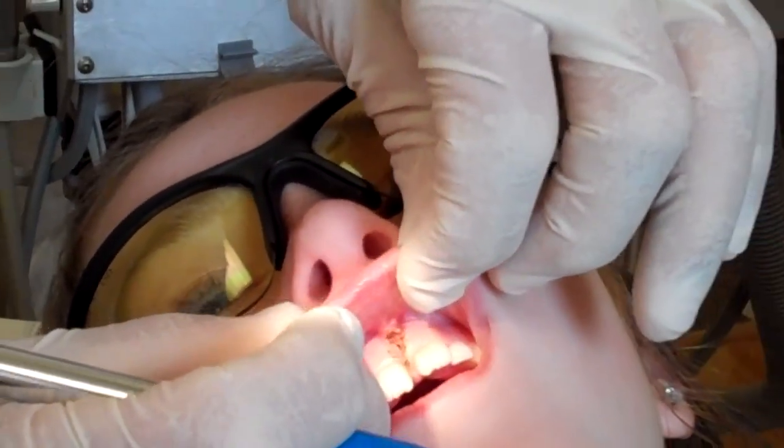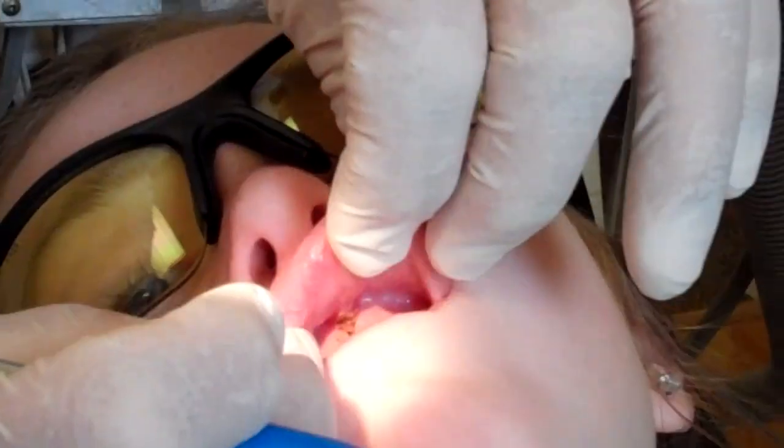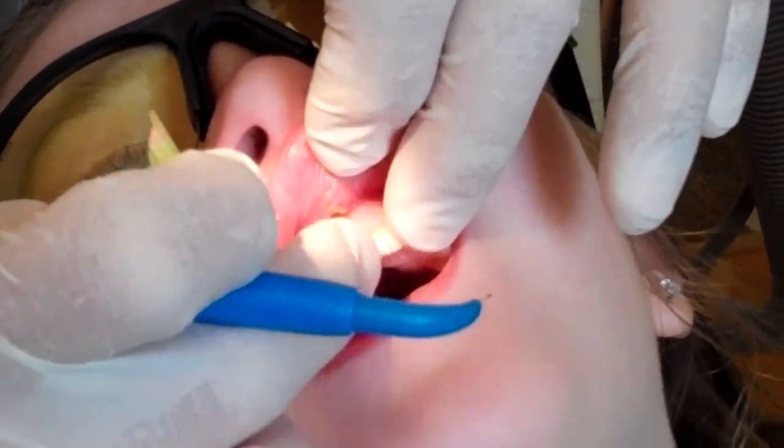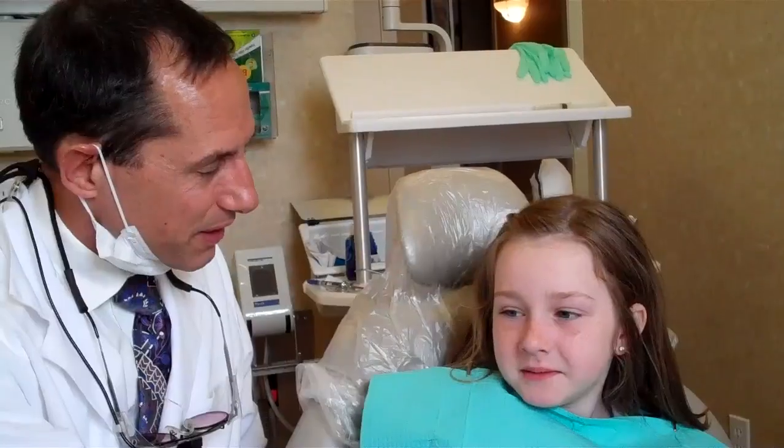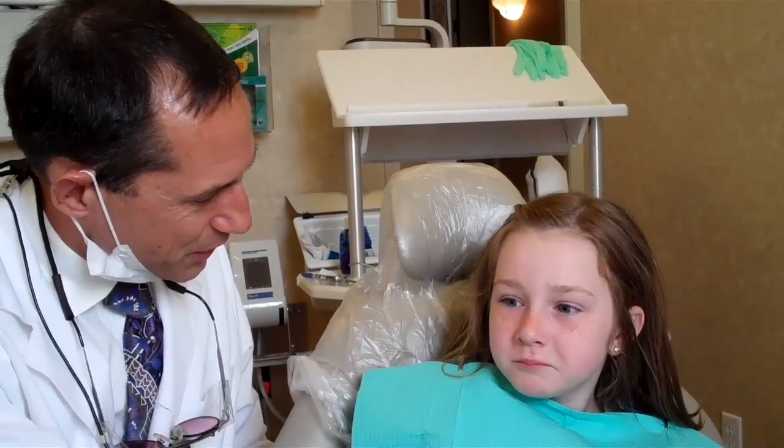So there we go. Now when she comes in, it'll allow the teeth to come together here and we should be good. Hannah, you did wonderful today — that took all of what, five minutes or so, and you did well. You felt maybe just at the very end a little bit of something, but how was that? It wasn't too bad. It's a simple procedure to do, and with the laser it'll heal very quickly. You'll be out today running around and having fun like a young girl should. If there's any questions, you can call us at our office at 586-247-3500, or visit our website at thegentledentist.com. Thank you, have a blessed day.